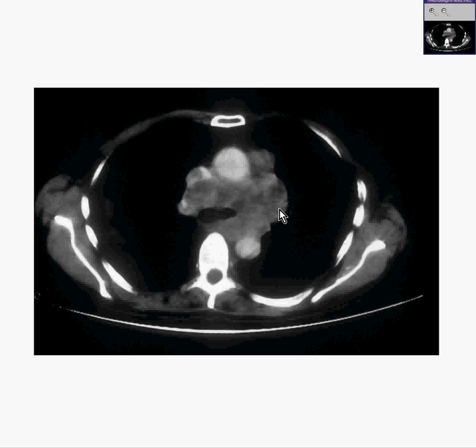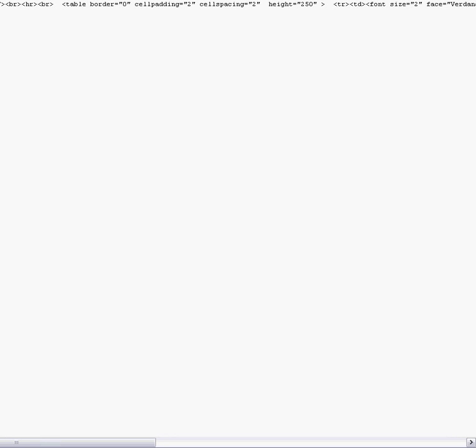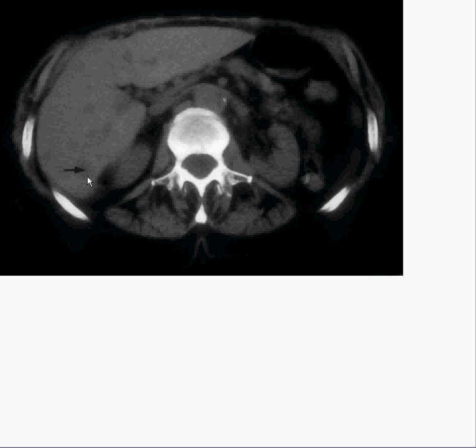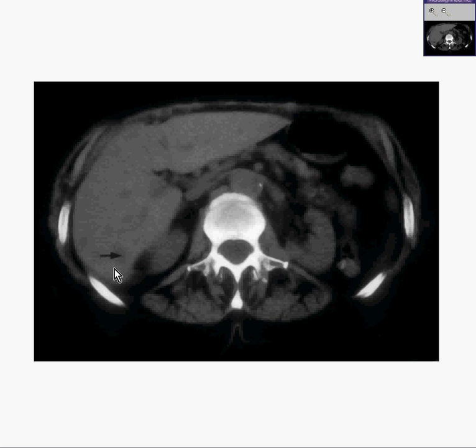You probably would not suspect this was metastatic because most of the tumor appears to be localized in this area rather than stippled throughout the lungs in general. If we move down to the abdomen, you can see something else. You can see a liver, classical. You can see that there are subtle areas of lucencies within this liver all over the place. So we have widespread metastases in the liver, but in the lung, it looks like the tumor is localized to the hilar regions.